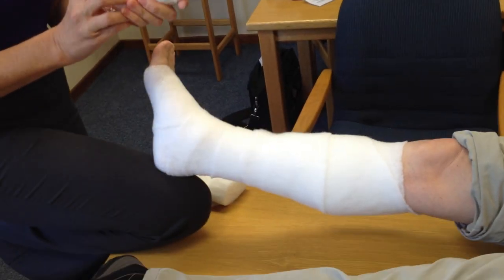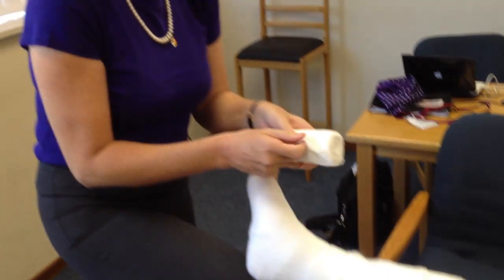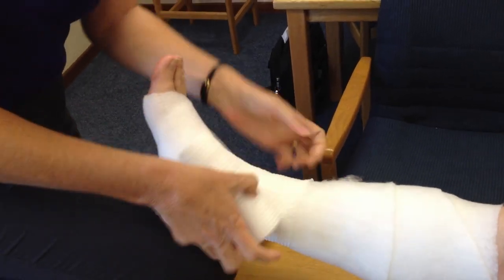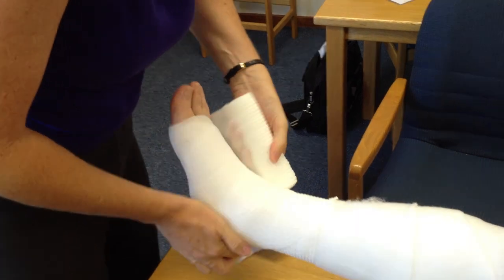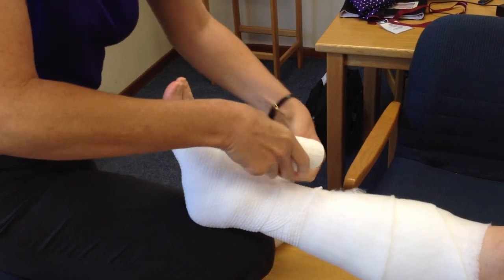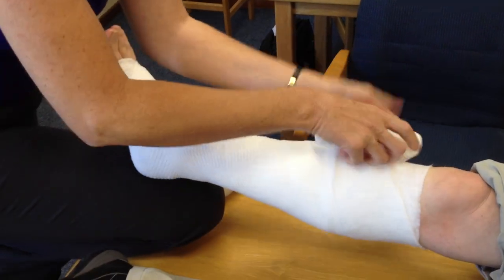Then we go to the third layer — same thing. I have put the whole system on in a spiral from right to left. In the last layer I just turn it around to the opposite direction. Again, starting at the ankle, go right around, over the heel, over the toe, back over the heel, and allow the bandage to go where it wants to go.